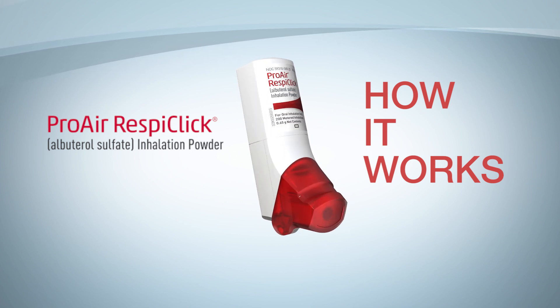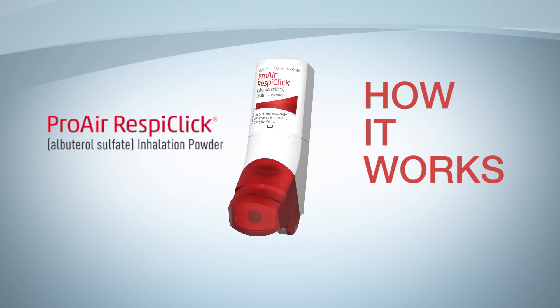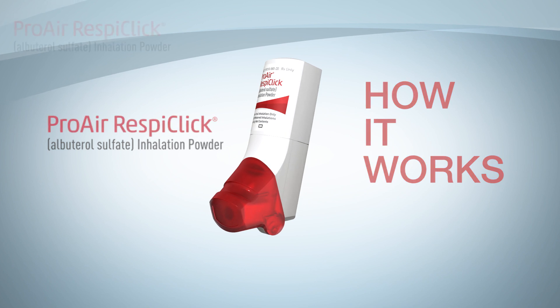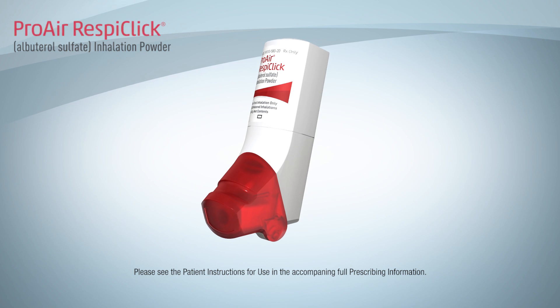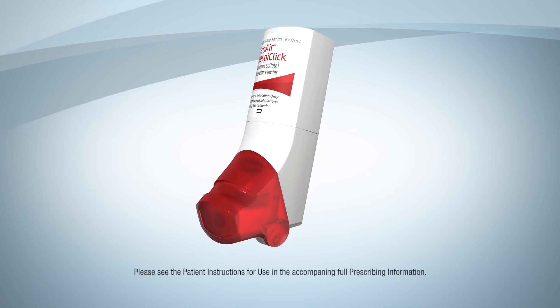This video is designed to show how the ProAir RespiClick Albuterol Sulfate Inhalation Powder Inhaler works. It's not intended to be instructions for use. Please see the patient instructions for use in the accompanying full prescribing information.